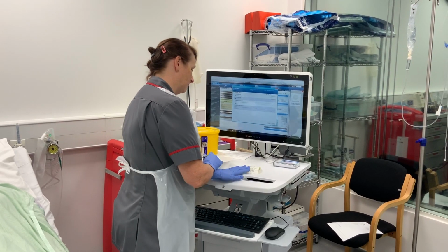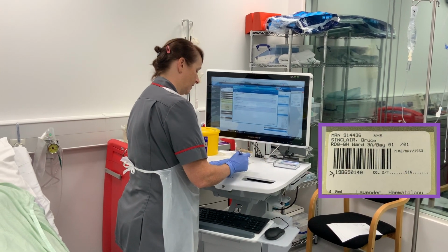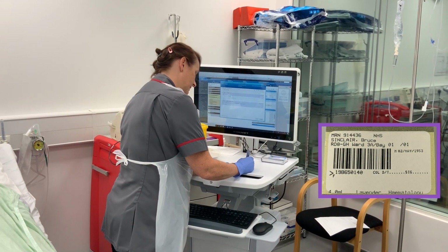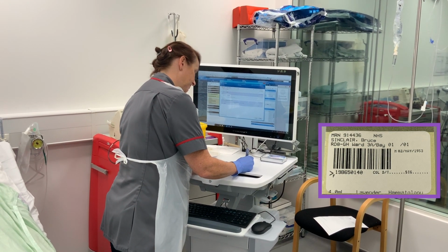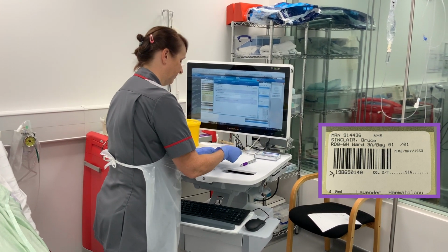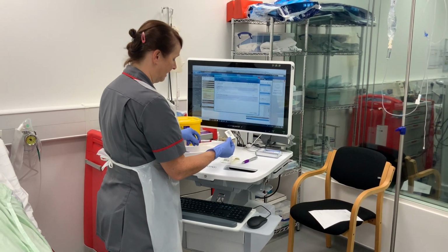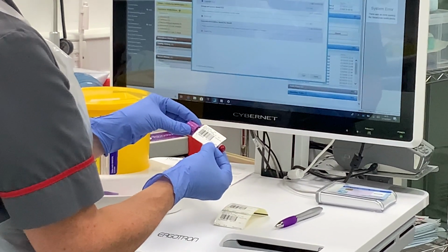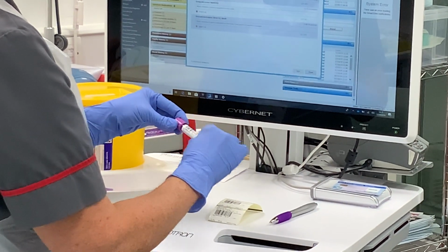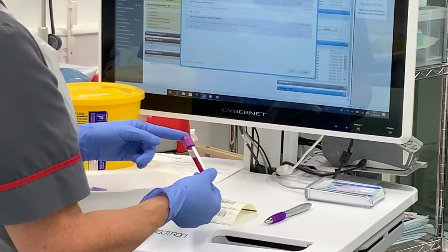So having taken my samples, I'm now going to label them, just ensuring that I choose the correct label for the correct bottle. So looking at the first label, I'm going to date and sign. And then selecting it, this is my haematology sample, my lavender bottle. So I put it onto the bottle with the barcode at the top. Just ensuring that it's in place.